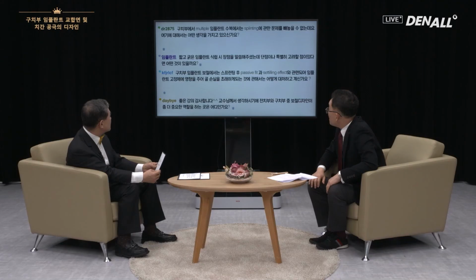You talked about the advantages of placing short and thick implants. Are there any disadvantages or anything to note? In the past, placing a short implant was conceived to be problematic because of the crown-root ratio. According to recent data, there's not much difference. Yes, it has been improved quite a lot.